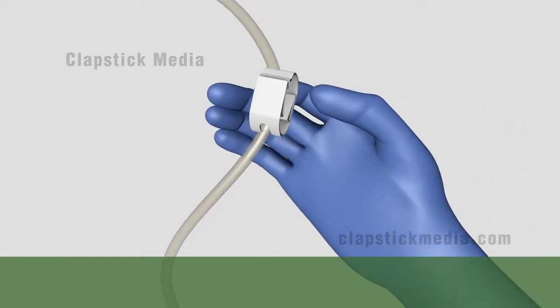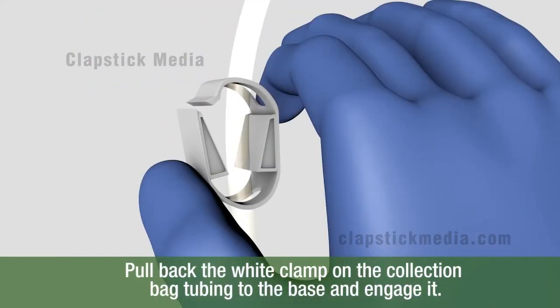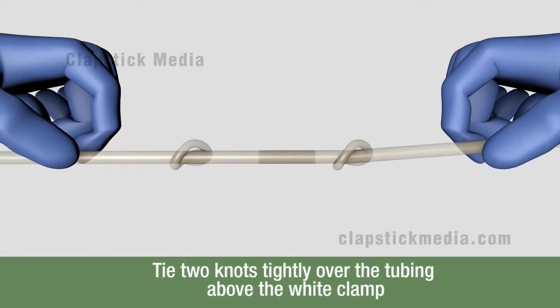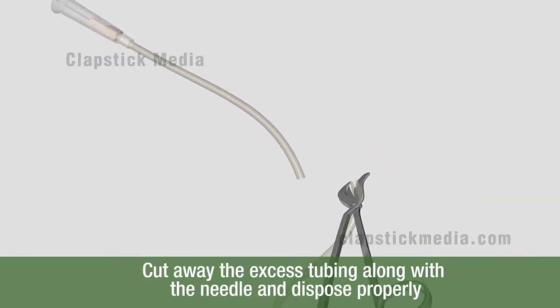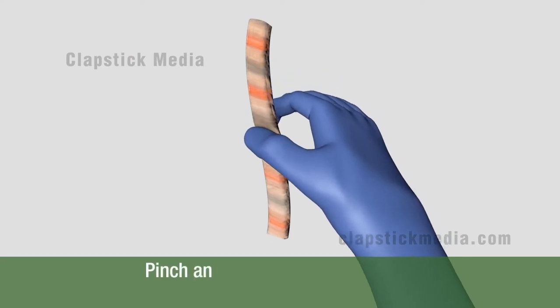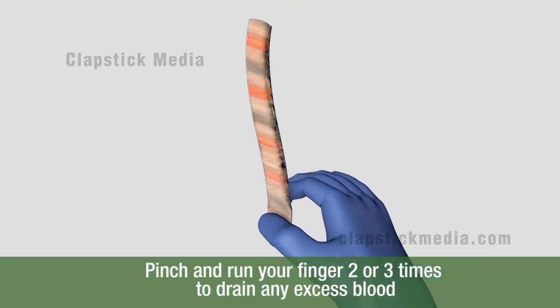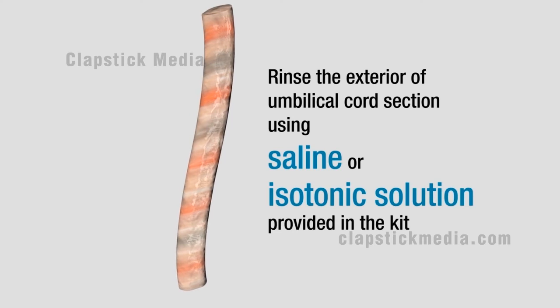Pull back the white clamp on the collection bag tubing to the base and engage it. Tie two knots tightly over the tubing above the white clamp. Cut away the excess tubing along with the needle and dispose properly. Cut as much section of the umbilical cord as possible. Pinch and run your finger two or three times to drain any excess blood.